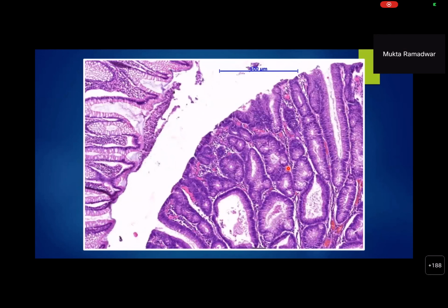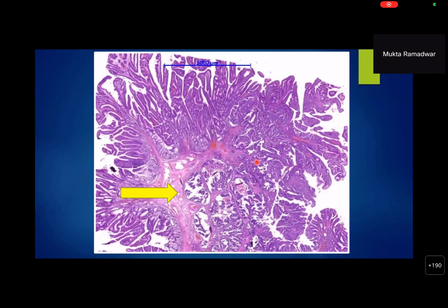So this is yet another part of the same adenoma. Why did I take this picture? There is a part of this stalk here which is normal, and then this is dysplasia. That comparison becomes very important. In a given biopsy, if you have normal colonic mucosa, make the most of it. Do not ignore it, because that becomes your basis of the morphology to compare your abnormal findings. So now moving ahead, this is a tubulovillous adenoma which is pedunculated.